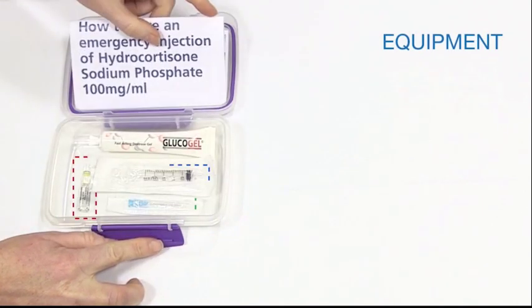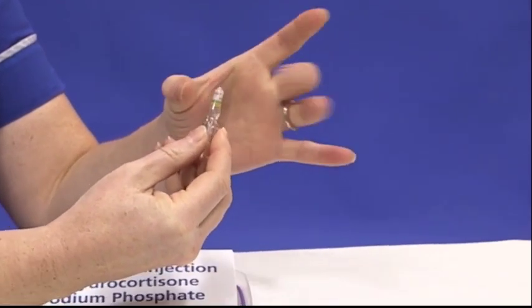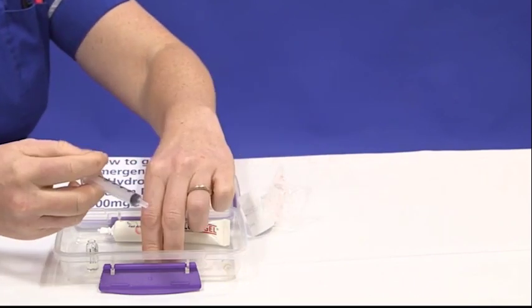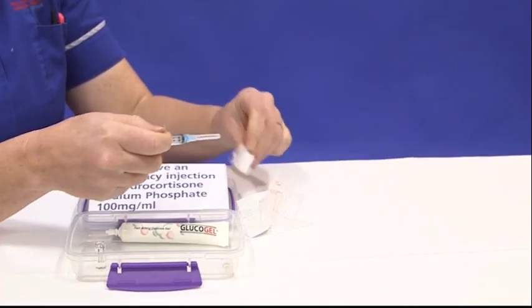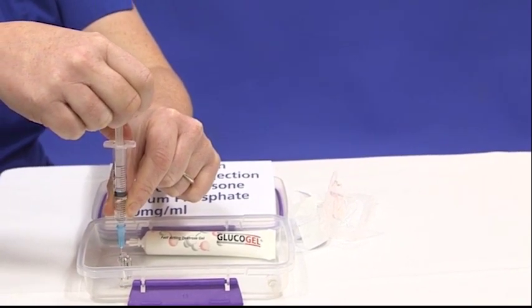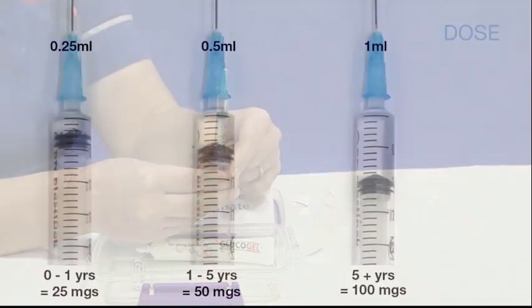This first injection is about how to give the pre-made liquid hydrocortisone. First we need to open the bottle of hydrocortisone. You're going to hold the bottle at an angle and tap the top of the vial, find the blue spot and break away from the blue spot. Next you're going to connect your needle and syringe together. By now you'll be shaking because this will be an emergency situation, so hold very tightly to the blue hub of the needle when you take the guard off. Put the needle and syringe directly down into the bottle and draw up the whole amount. Now we need to get rid of the air — with the needle pointing directly upwards, give a big flick on the black plunger, the air will rise and you can just push the solution through until it comes out of the tip of the needle.